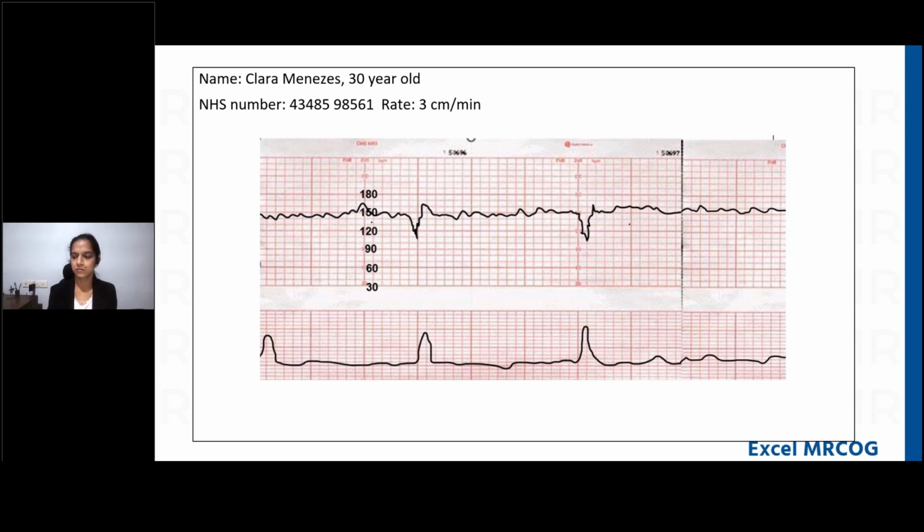When the contraction passes off, in that case you can see the deceleration, it is going down, and sometimes even up to 90. And even rarely, you can see in the labor room when we are seeing the patients, suddenly it drops, it can be going up to 60 and so on. In that case also, as I already told you, it should be the whole clinical picture. We cannot treat the CTG alone. Suppose, for example, the patient has any meconium or any high risk factors, like the patient is already IUGR, so like that we have to correlate.